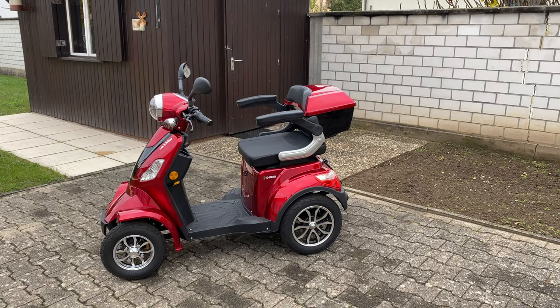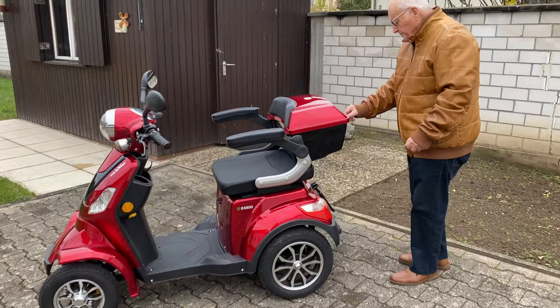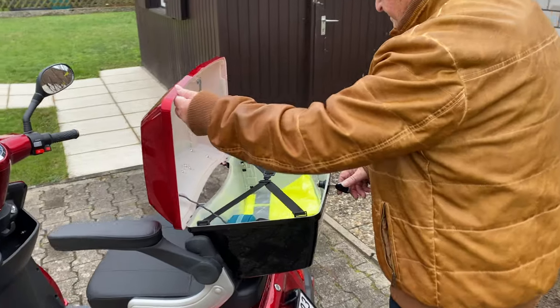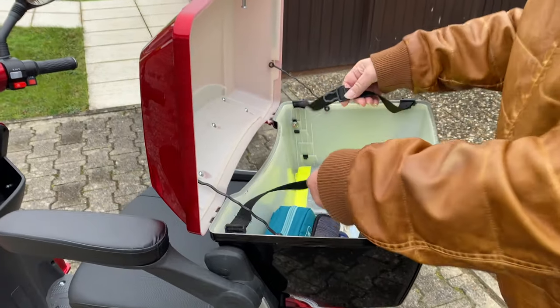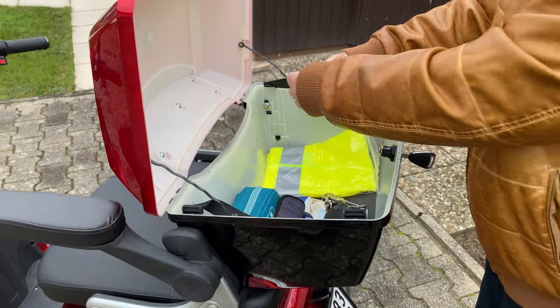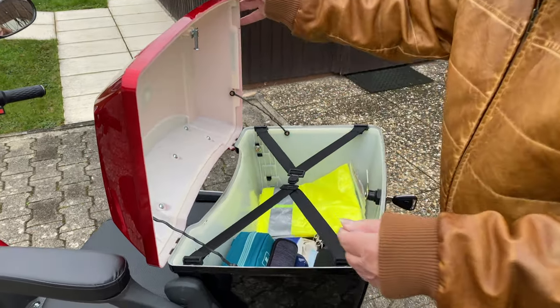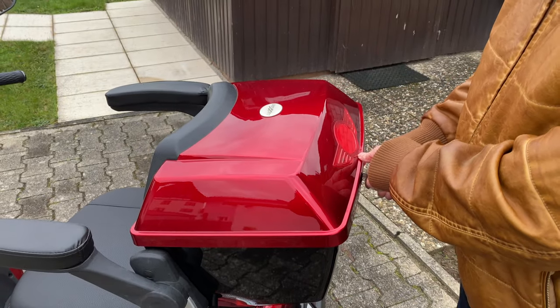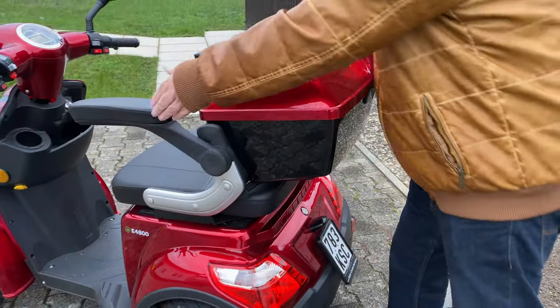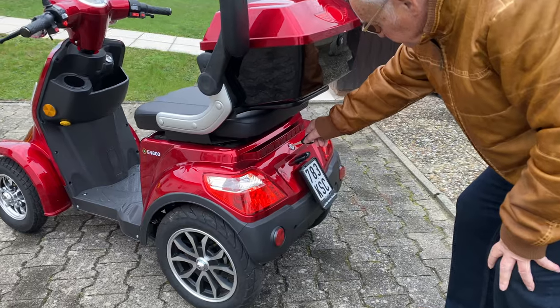Hello! In this video I would like to give you useful information about a current electric mobility scooter, also called power mobility scooter. All given information applies to Germany. At the beginning I will take you on a real ride where you will also get a feeling for the speed, and during that ride you will learn some basic details about electronics. After the ride I will show you some equipment details.